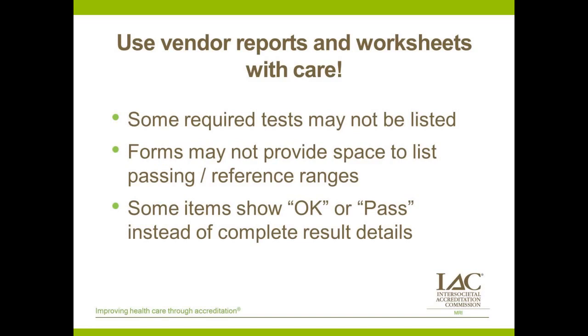So you may have to get creative and either modify some of those forms for your own daily QC or design your own. And again, sometimes you'll see these reports where there's some kind of detailed data that's in the background, but what you receive is something that just says okay or pass or a check mark, and you're not able to look and say, well, what's the valid range? What's the number from this measurement? And it may be difficult to get that depending on how the company that's doing the service is documenting that information.